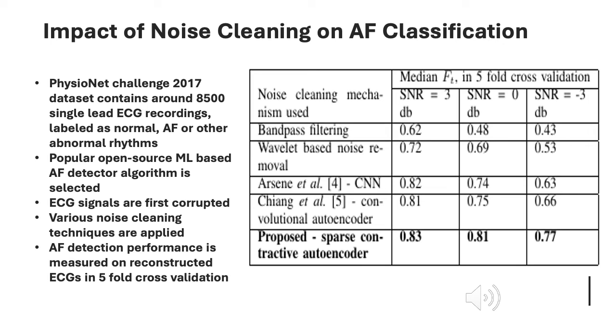The algorithm first derives a set of 150 handcrafted features related to ECG morphology and short-term heart rate variability. The feature set is applied to a series of cascaded binary AdaBoost classifiers for classification. Classification performance is reported by the metric FT, which is basically the average of the F1 score of detecting normal, AF, and other rhythms. The median value of the metric FT is measured as 0.85 on the original non-noisy dataset in a 5-fold cross-validation. Subsequently, the signals are contaminated by addition of noise.